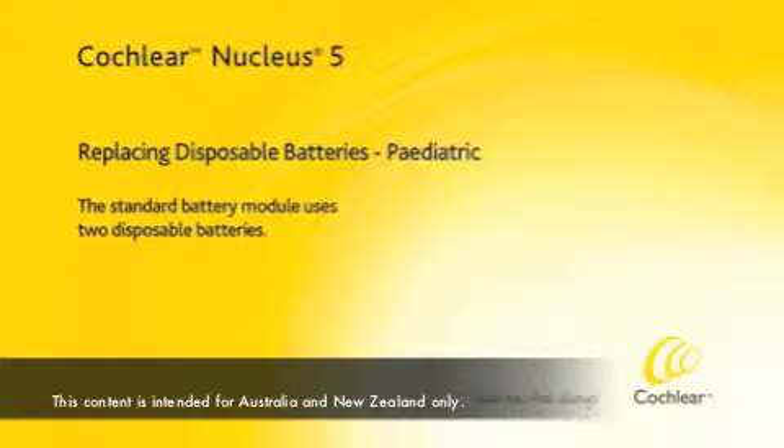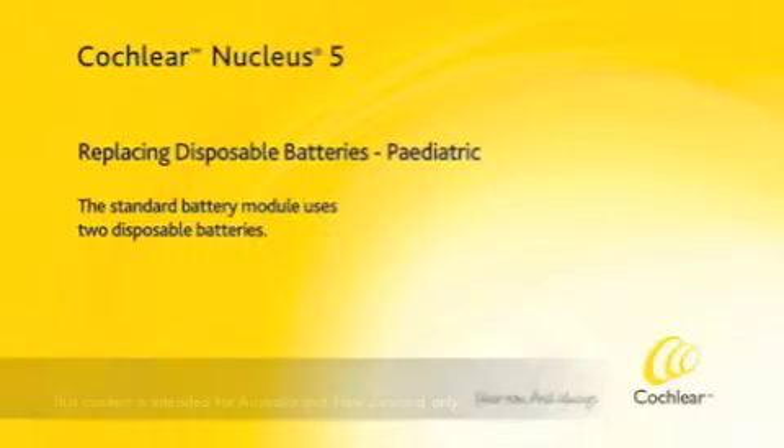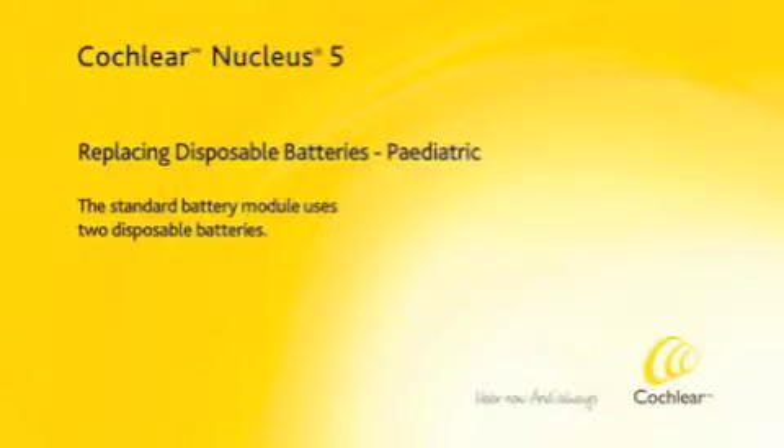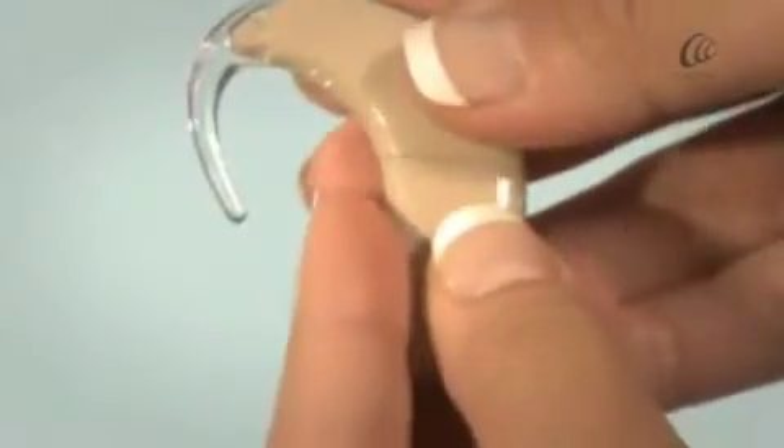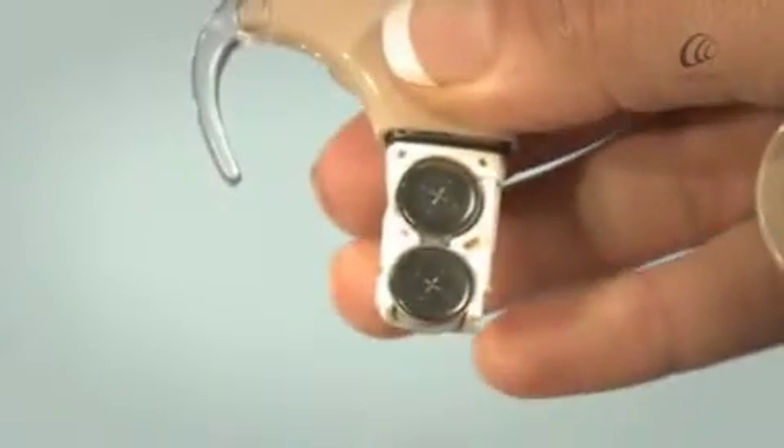The standard battery module uses two disposable batteries. Unlock the battery cover by gently turning the lock anti-clockwise until vertical. Slide the cover off and remove the batteries.